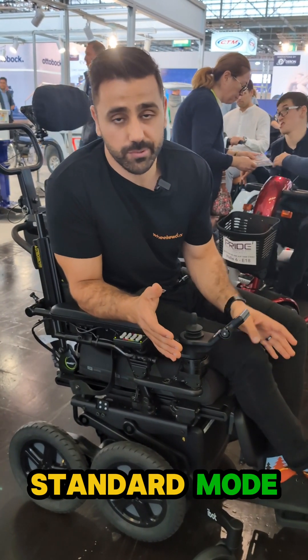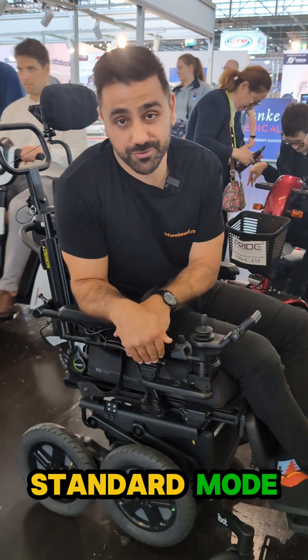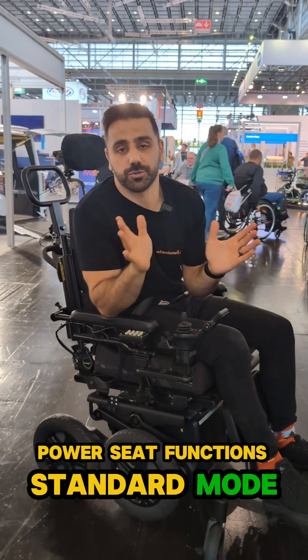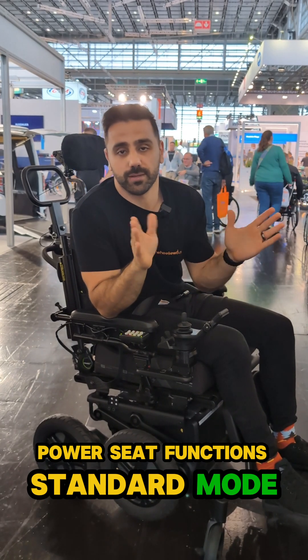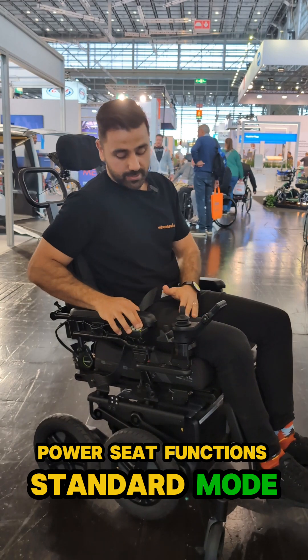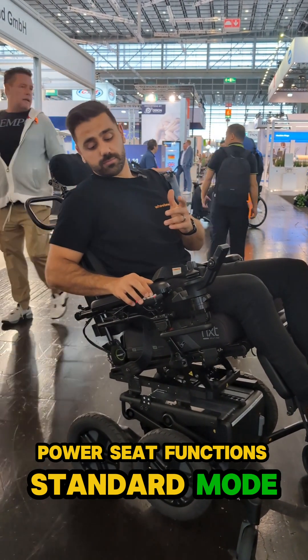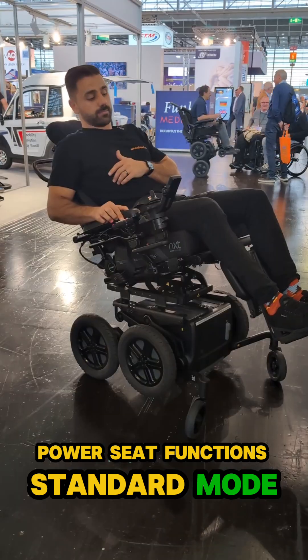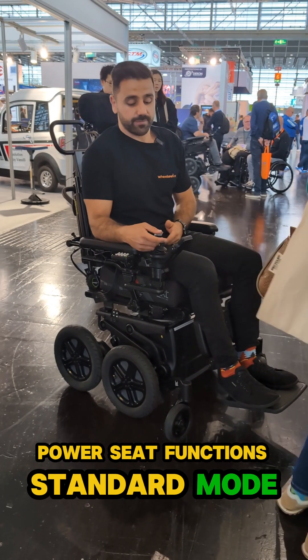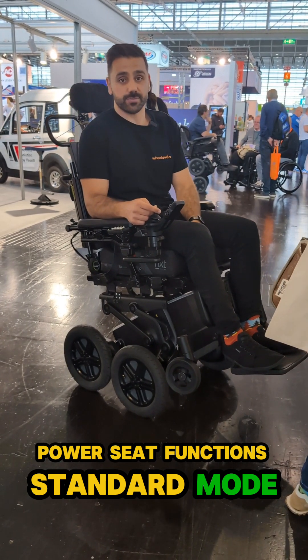Then of course we have our regular mode which allows us to get our knees under tables, and it's the most stable mode. With this new version of the chair we can use power seat functions — historically this chair could only drop, it couldn't do tilt, elevating legs, recline, or any of those. But now it can: full function to go back into tilt, recline, and even elevate the legs. The chair can lift through the base but also through the seating system itself, helping with transfers as we come on up.